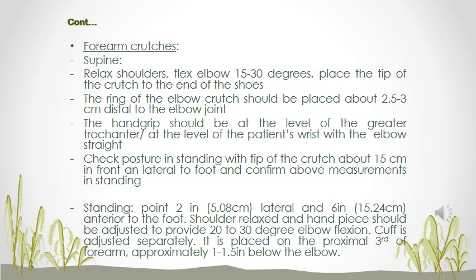When we look at measuring in standing, take a point 5 centimeters lateral and 15 centimeters anterior to the foot. Place the tip of the crutch, meaning the bottom rubber tip, in that position.